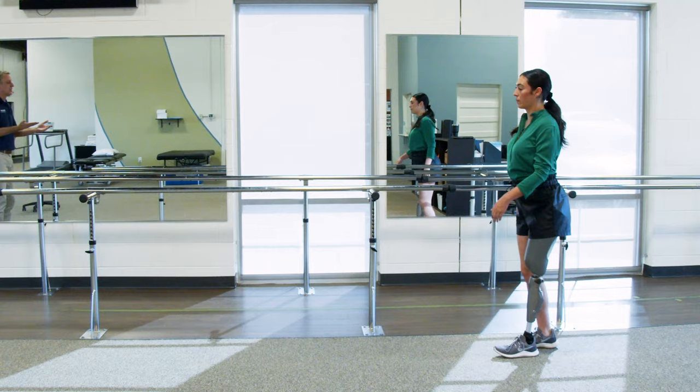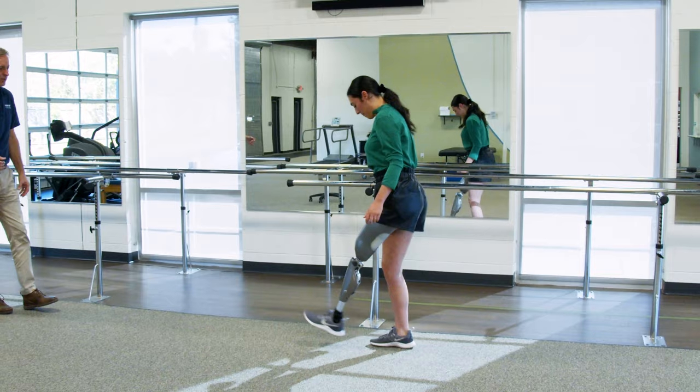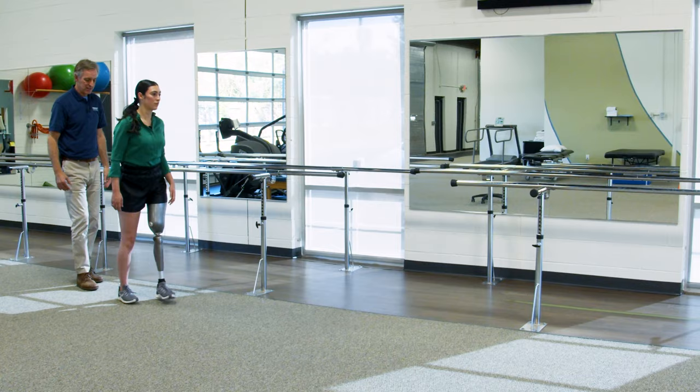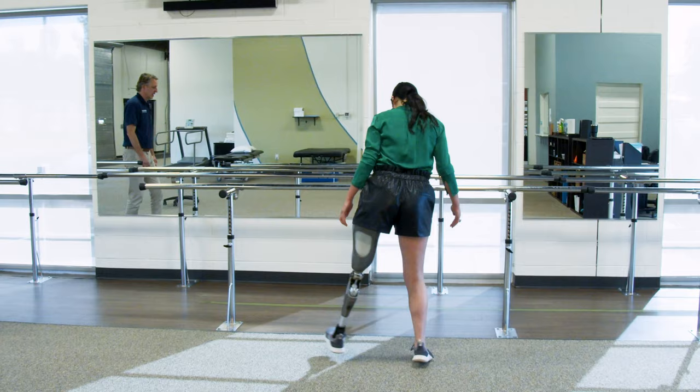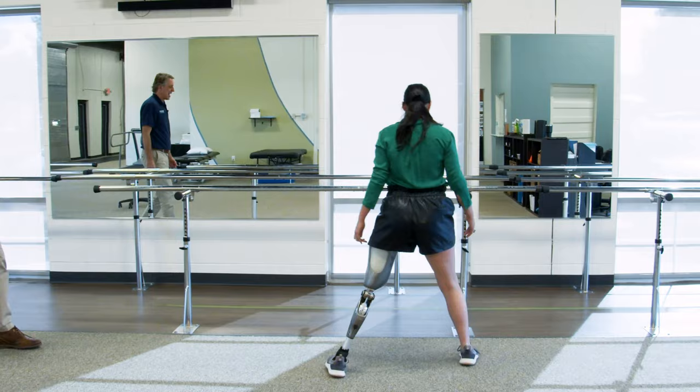Start right off with a chop step. Don't work too hard. Just get it in the ground. There you go. Just walk through it. Good. Walk a normal step. Good, turn around and walk normal back. And now long step, giant step, and stop. Excellent, turn sideways. Good, and side step towards me. Excellent, side step away from me. Good, come back again, hold right there.